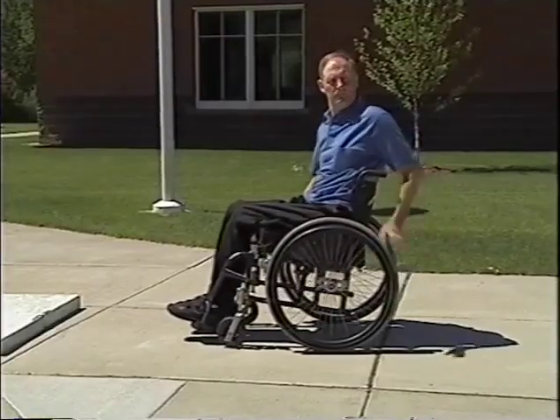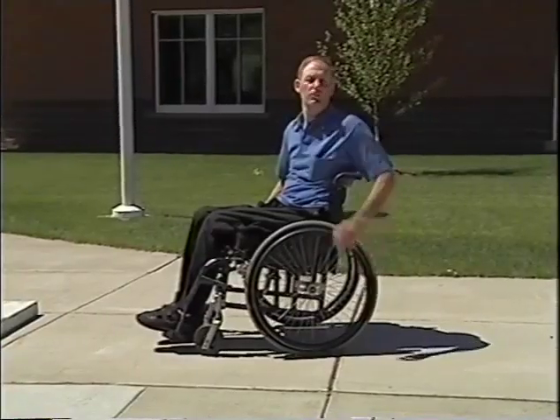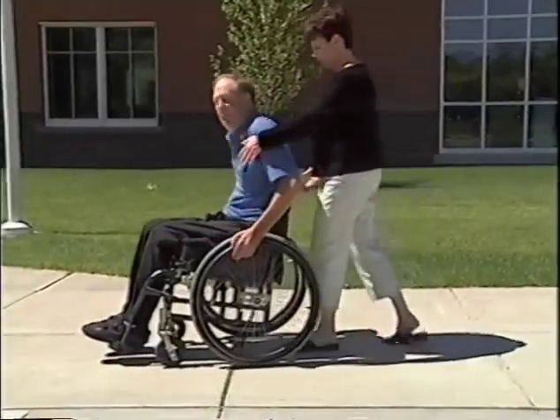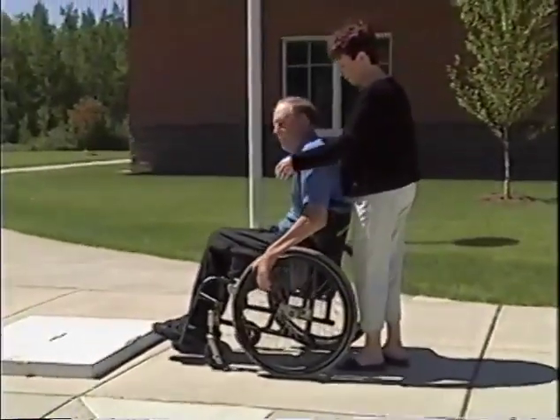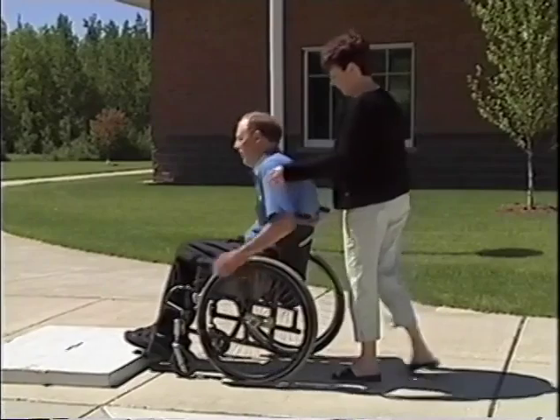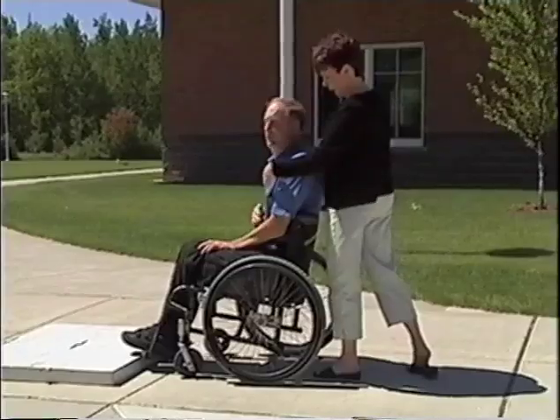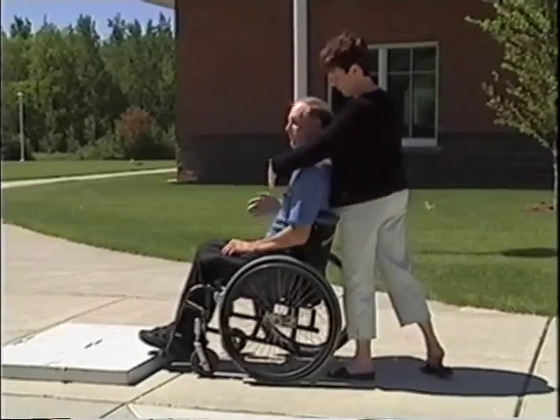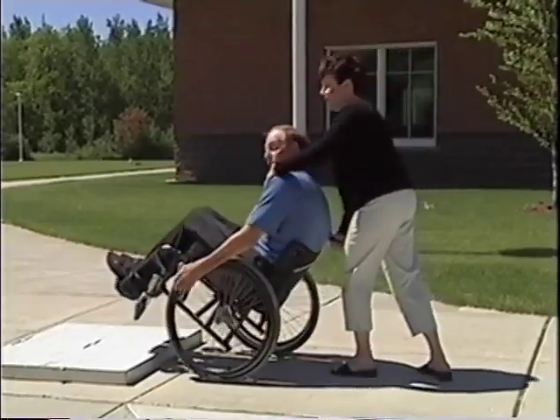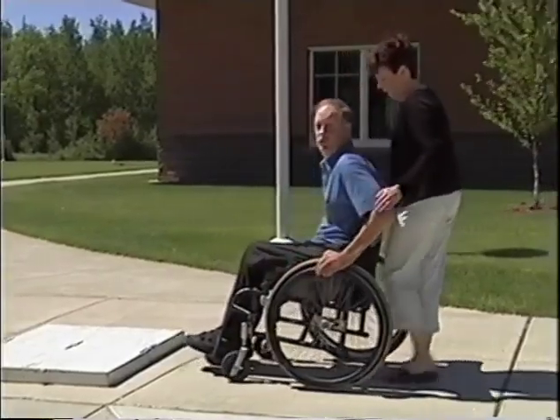Meg, could you come spot me? Stand. All right, and you'll put one hand in front and one behind. Okay. When you're teaching this, if you're spotting, you want to be able to stop. If somebody hits the curb and bends forward, if they have on a body brace, then it's going to really cut into them. So you as a therapist will be able to stop them from falling forward. Or if they fall backwards with too much wheelie, you can catch them. So those are the two things you'll be looking for when you're spotting.